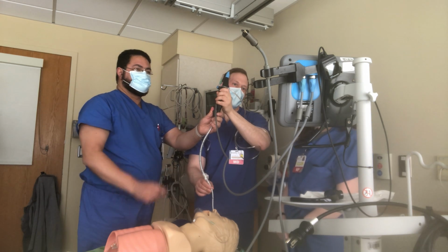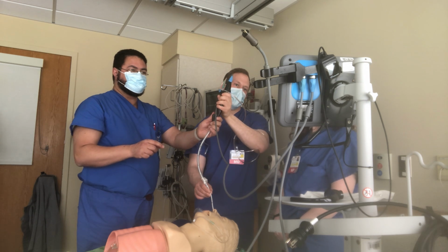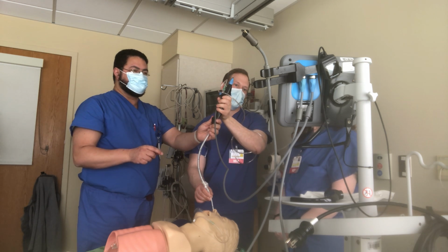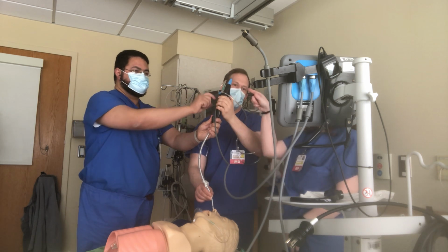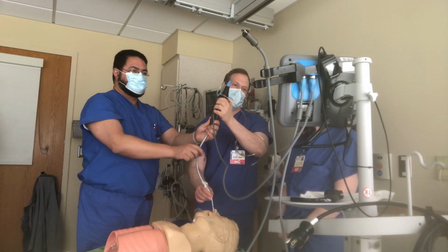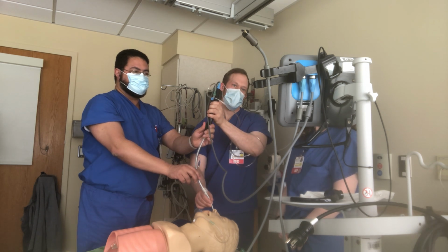Right. And then is it in the middle? Yes. So if you push, it's gonna go in, and you need to adjust that position. Oh, it's not in the middle anymore. So what do we do? Retroflex. Push by this one here. Push this up. Yeah, and push. Oh, turn. Push it up again. Up.